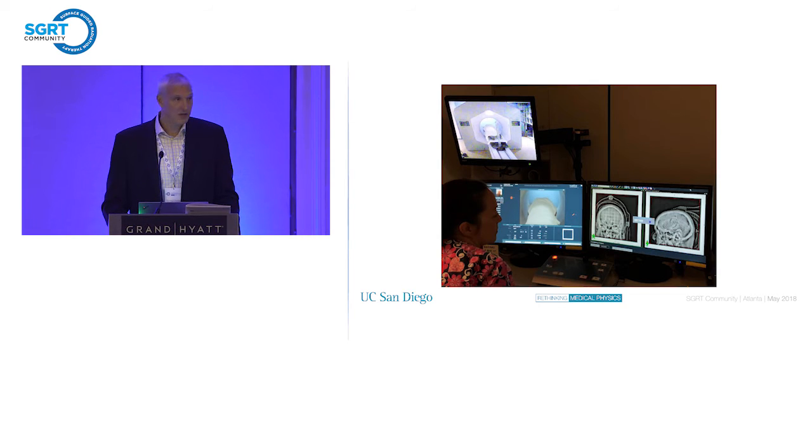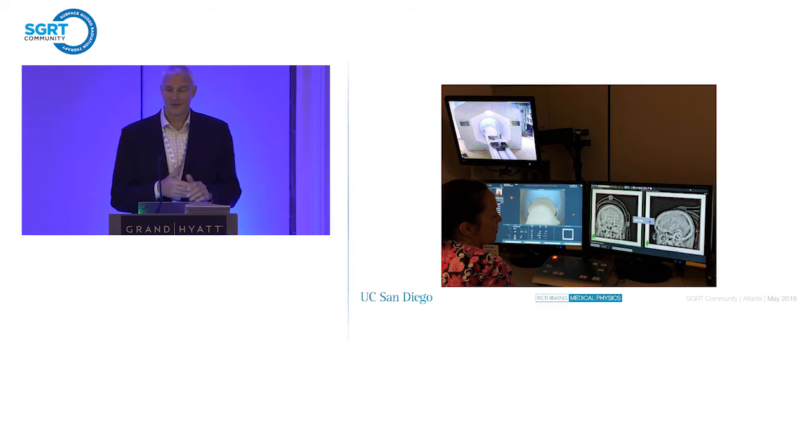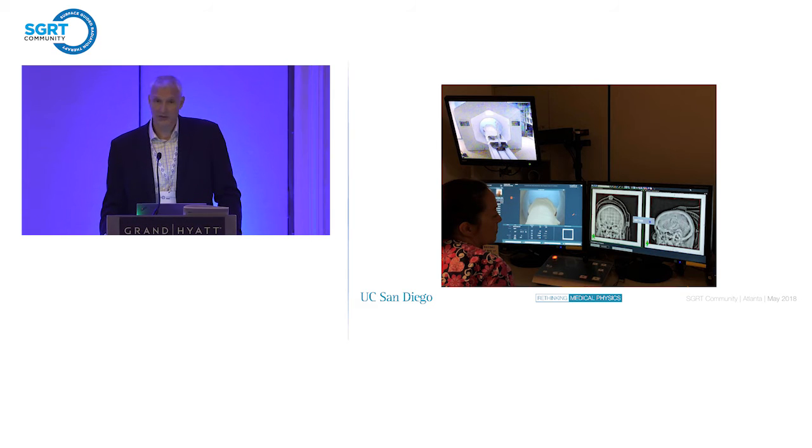The patient is imaged for every fraction, and then the treatment proceeds. So again, our average treatment time is about 8 minutes. So even for the cases that we're doing this in, on average, getting 60 patients through the treatment is a pretty significant accomplishment, and speaks to the workflow of not only the Halcyon, but also the Align RT system.